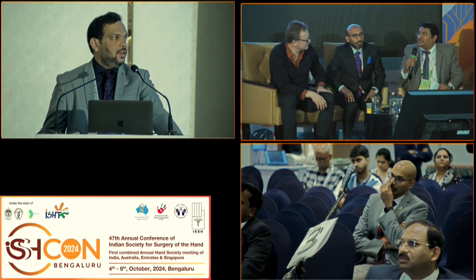Yes, if there is a central tear, then definitely this is going to help. Again, the question comes, if there is no tear, then a DRUJ scopy is going to help, but to resect through the DRUJ scopy is very challenging. Very challenging. If there is no central tear, I would think twice about the diagnosis, because for me, there can't be ulnar impaction syndrome if there is no central tear, but that's my thought.